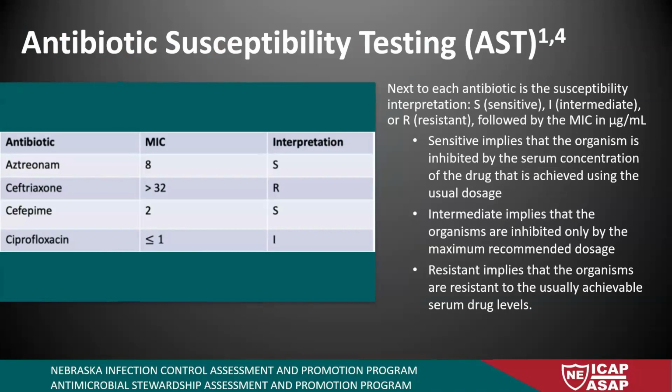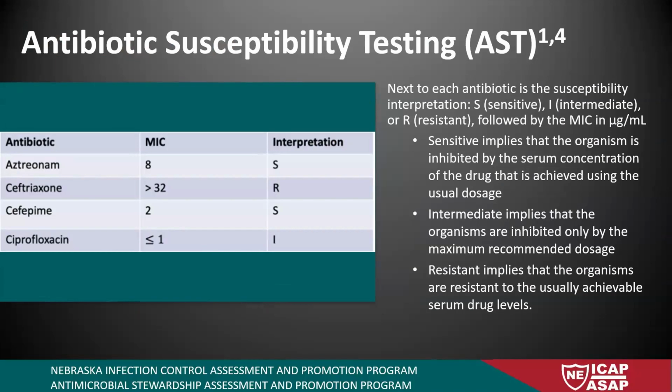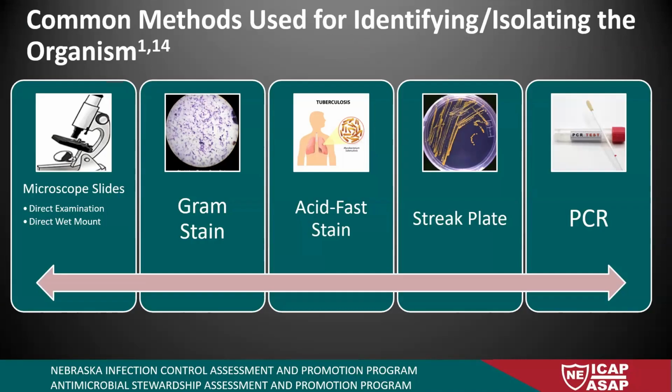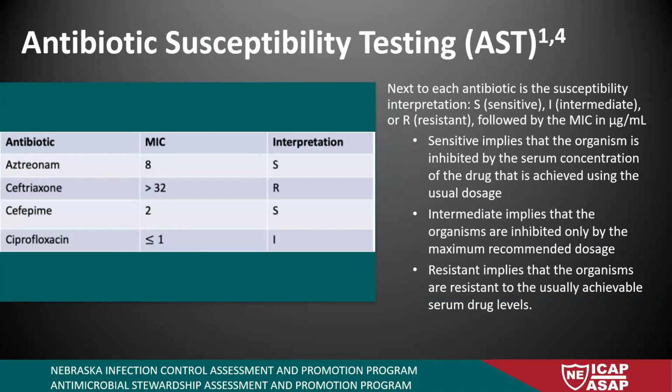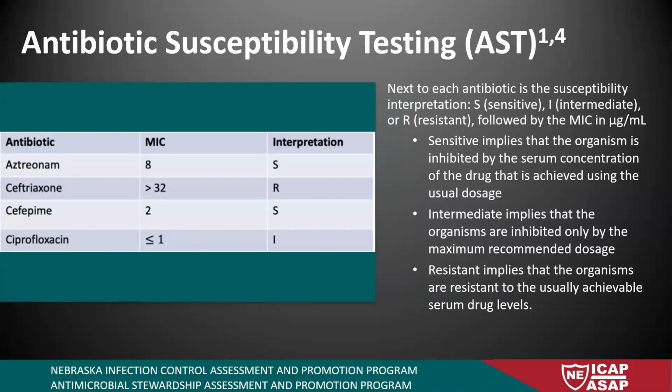But then there's another example of where sometimes you find more than one thing in there. There's more than one type of yeast or something. So this patient had more than one, but they had moderate Candida auris isolated with rare exception. Like this was a bronchial culture. So they're not thought to cause pulmonary infections, more likely to be a colonization or a contamination. But you would also want to look to see what kind of symptoms the patients were having and why they collected the culture in the first place.